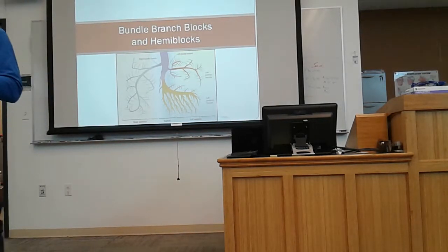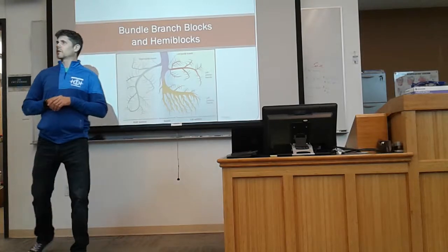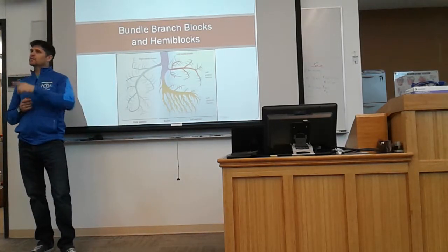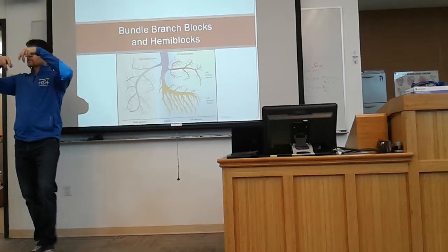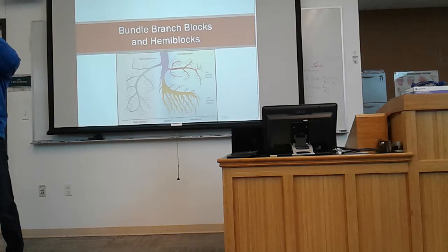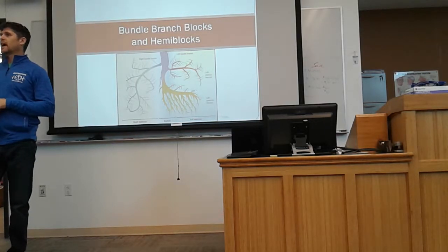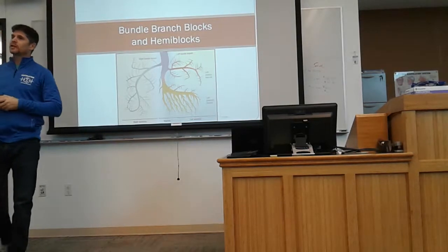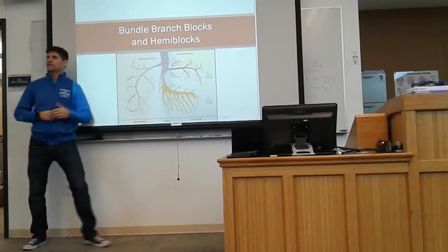Because they just look like two little things stacked on top of each other, right? And then you just lose. Not always. Yes and no. Sometimes your R and R prime don't look like two QRS complexes that look normal. Sometimes one of the R's, the R or the R prime, looks funky and weird. It doesn't always look exactly like two QRS complexes. That completely depends on how cell to cell one side is versus the other.